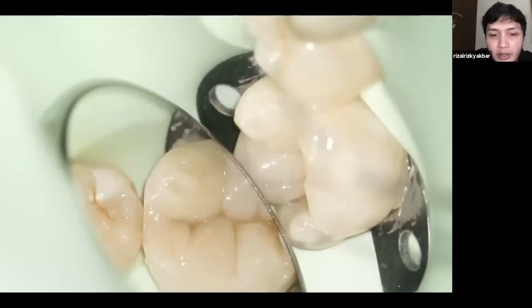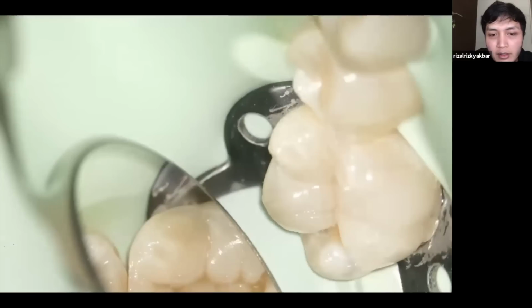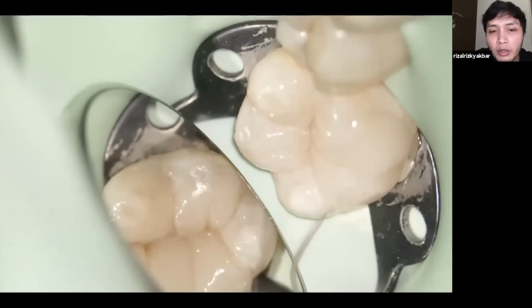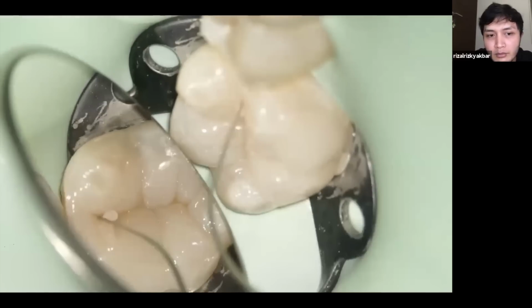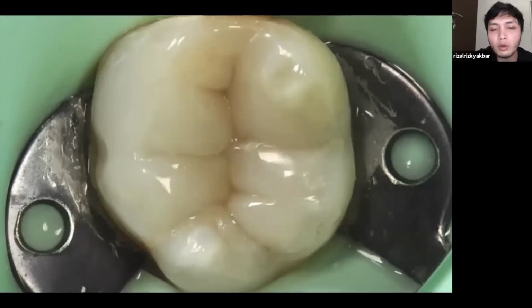I forgot to mention this. Let's say your patient is a dentist and he doesn't agree with the brown stain or something, you can use transparent flowable to close all the gaps. Yeah, just put a little amount of flowable. Make sure that you don't leave too many gaps, and then close it with a flowable.